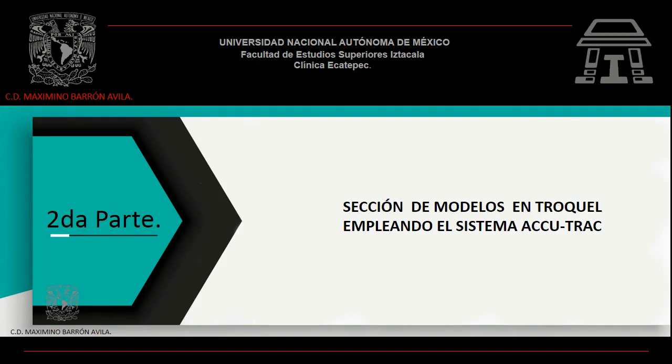Sección de modelos en troquel empleando el sistema ACUTRAC.